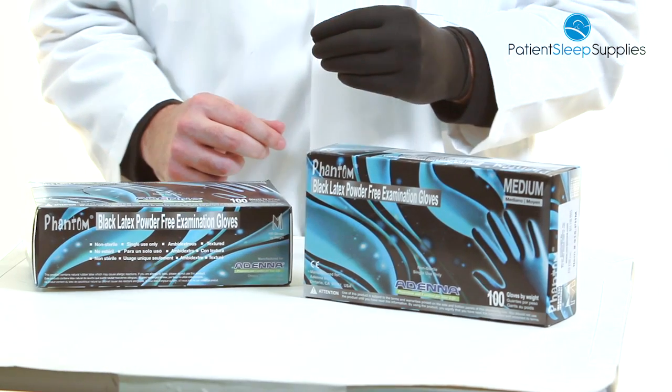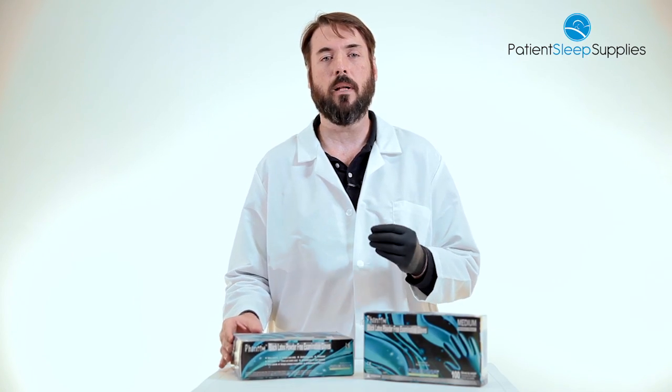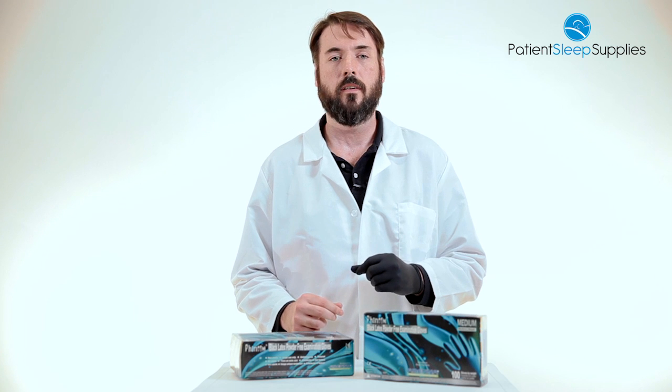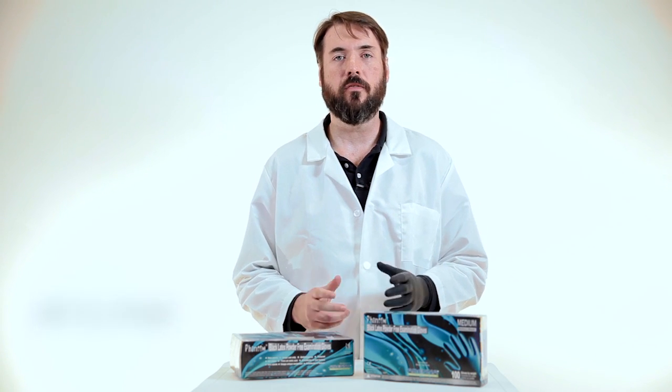Comes in a box of 100, available in small, medium, large or extra large. Again this is the Phantom Black Powder-Free Latex Glove, item number 915-PHM. Thanks so much for watching.